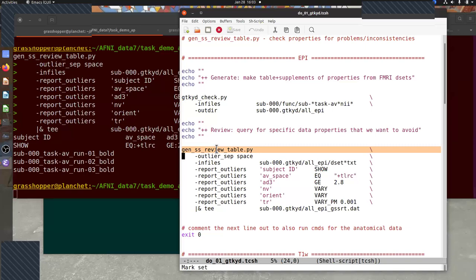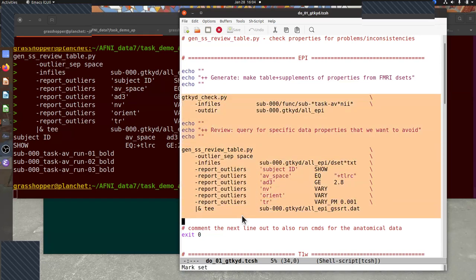You have to push buttons, and it's very easy to make mistakes. I don't mean that facetiously, I really mean it seriously, because scanners kind of fight with you about properties, and loading a file, the file names can be pretty awkward, and so you might not get the right one. A version update on the scanner software might change things entirely.